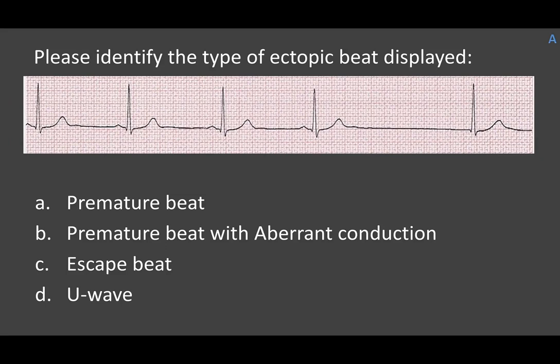Review question: identify the type of ectopic beat displayed. Looking at the strip, there's a big gap and then the heart rhythm picks back up. This beat has P waves in front of it, but the escape beat does not. This is not a case where the rhythm stopped and picked back up — we're looking at a late beat of a different type altogether because it doesn't even have a P wave. This is likely a junctional beat — a junctional escape beat to be specific.